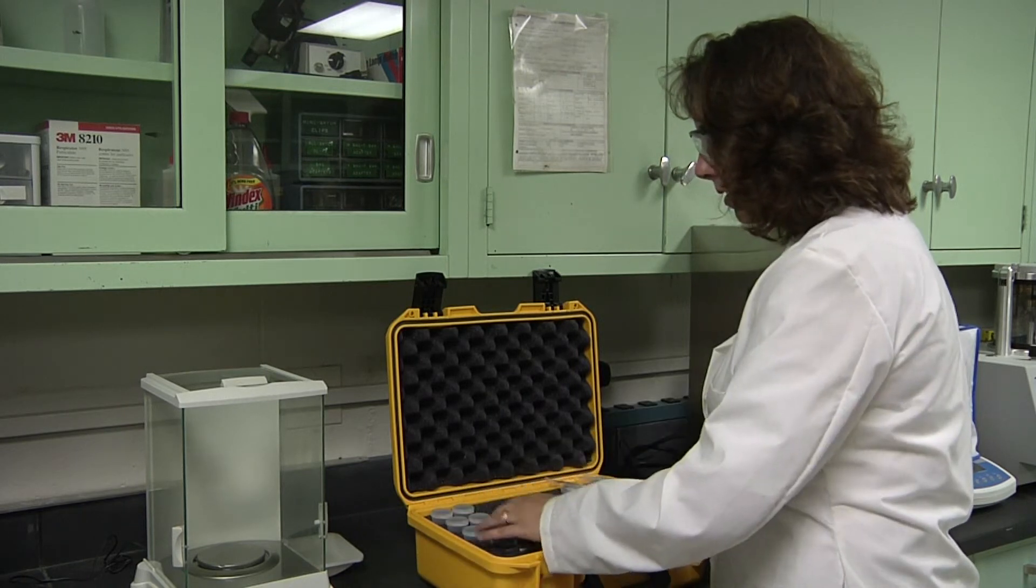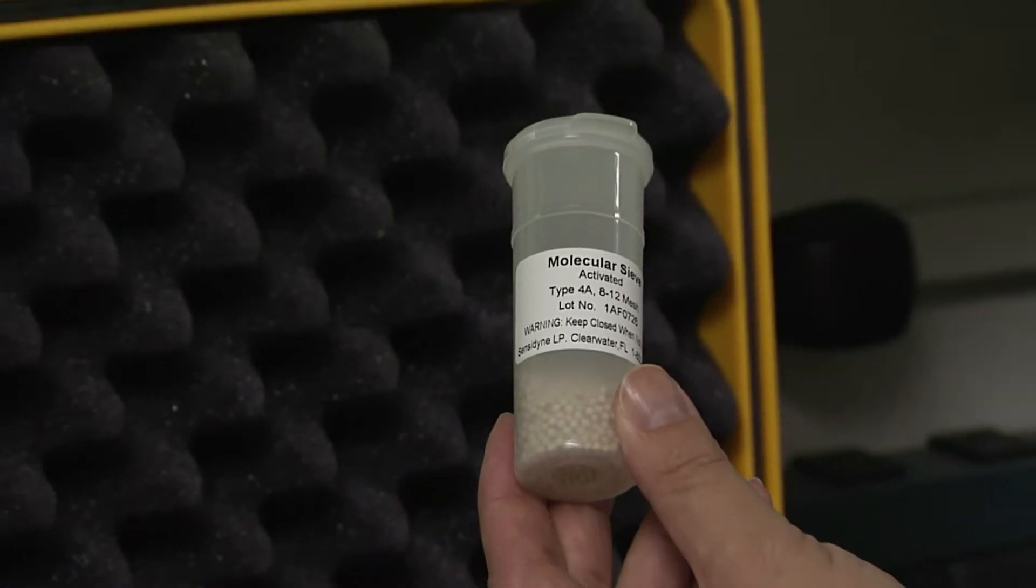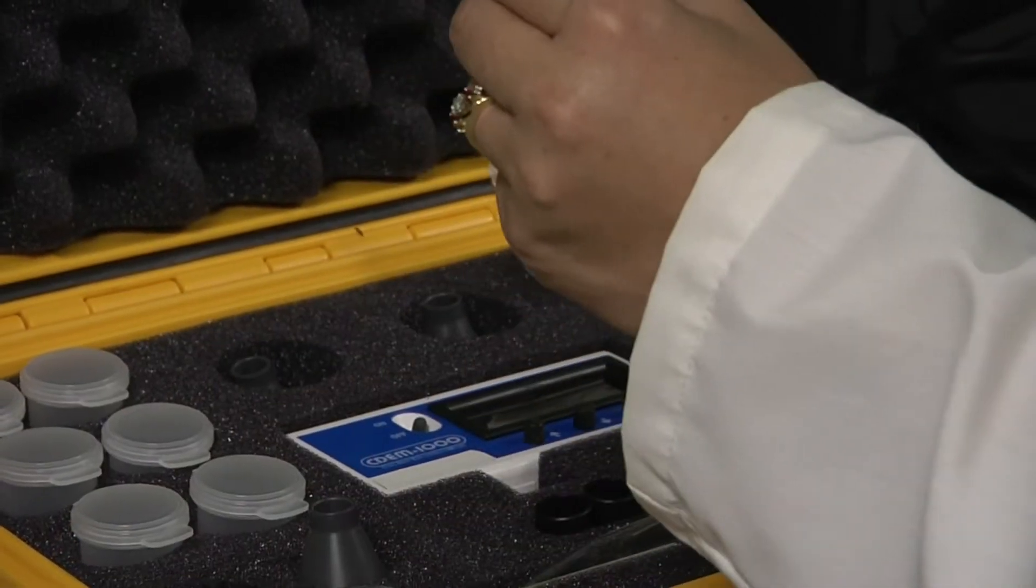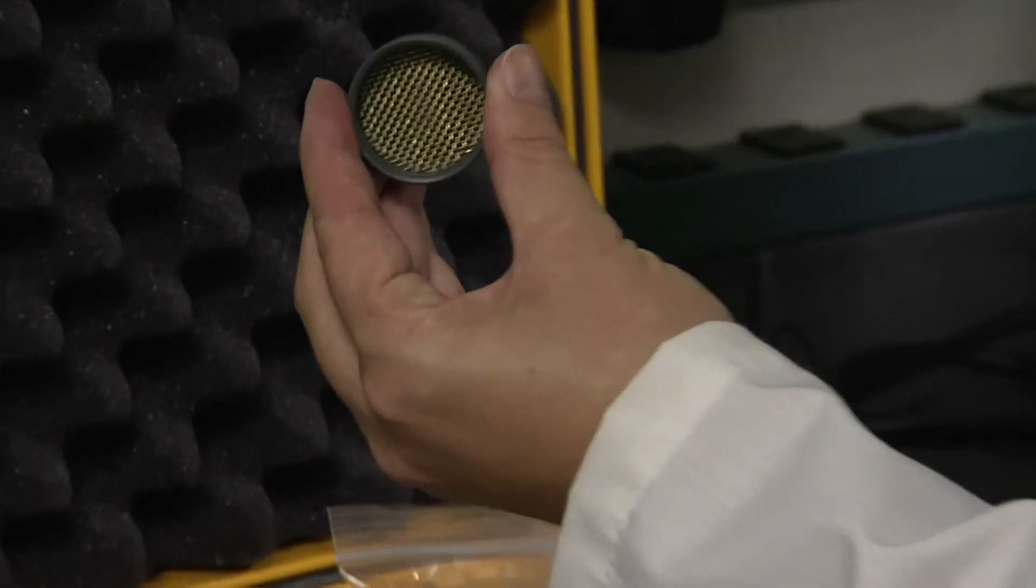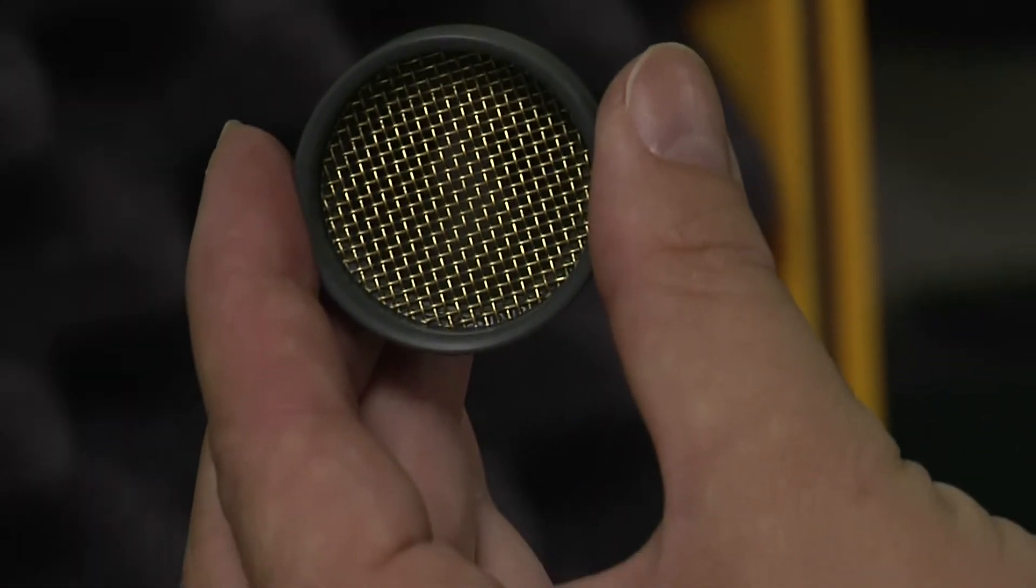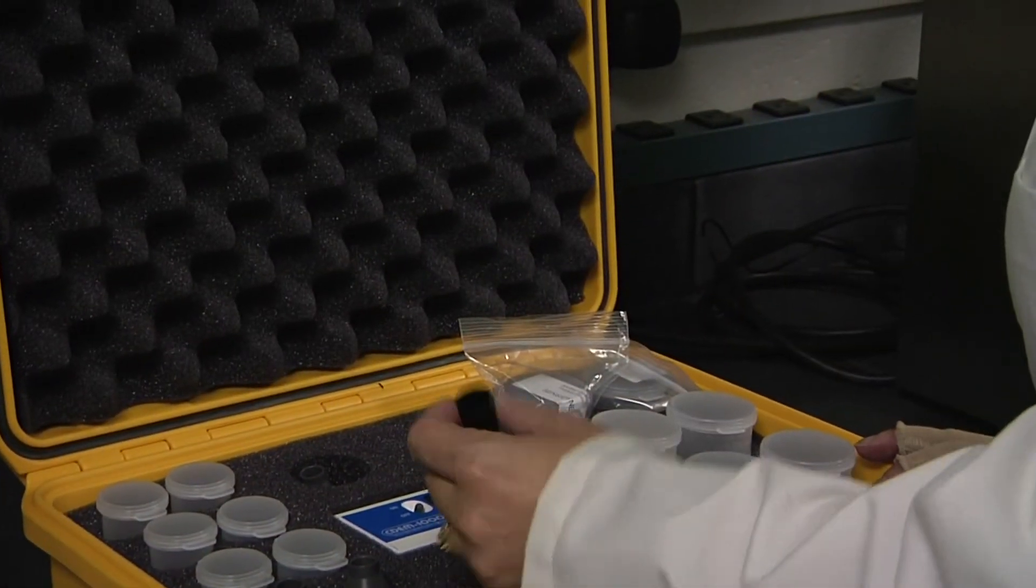You will have six sampling vials filled with activated sieves, two funnels with a 20 mesh screen. Those funnels are for sampling. You'll also have five sampling cups.